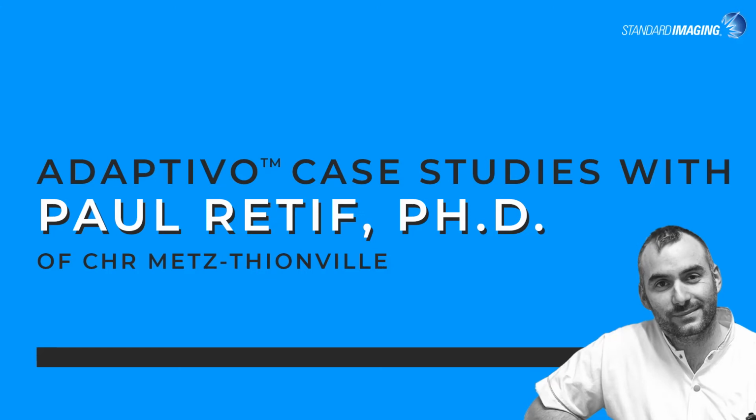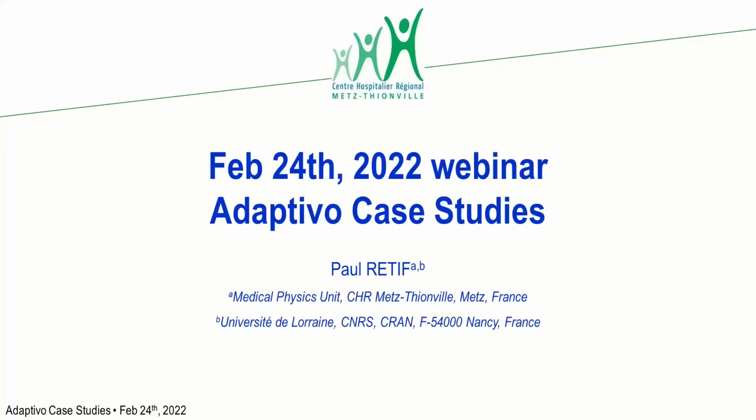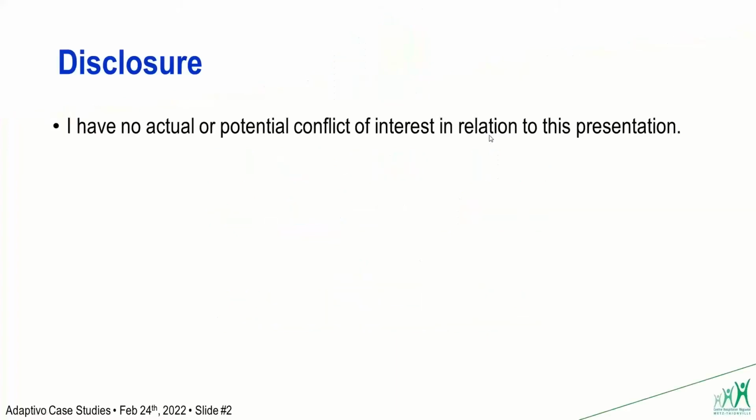So today we will be talking about Adaptivo, which is a software proposed by Standard Imaging, and in particular the In Vivo module of that software. I have no conflict of interest to declare.